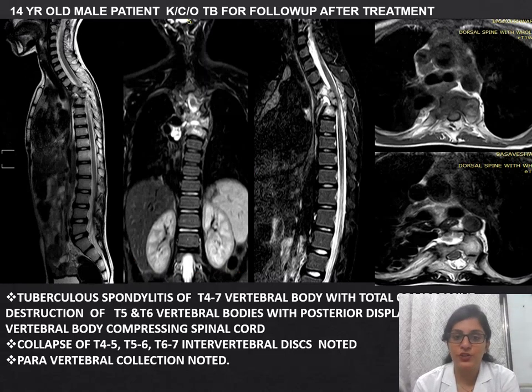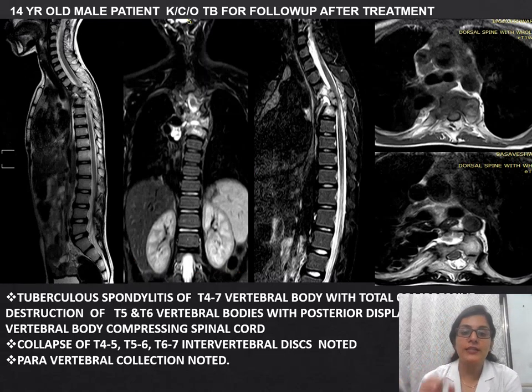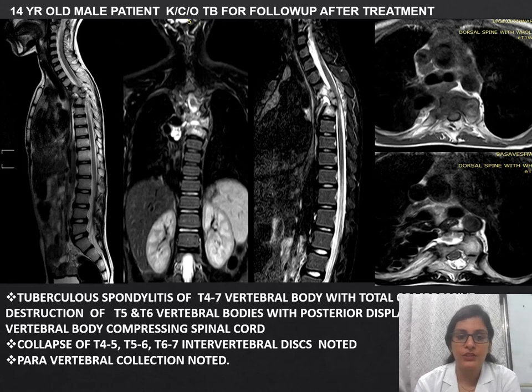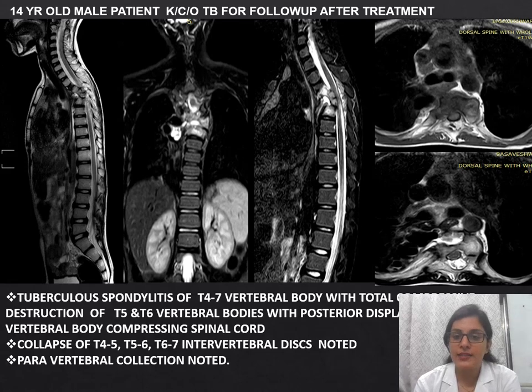Next patient: a 14-year-old male, known case of tuberculosis, on follow-up after treatment. MRI shows spondylitis of T4 to T7 vertebral bodies with total destruction of T5 and T6, posterior displacement of the vertebral body compressing the spinal cord, collapse of T4, T5, T6, and T6-T7 discs, and paravertebral collection.